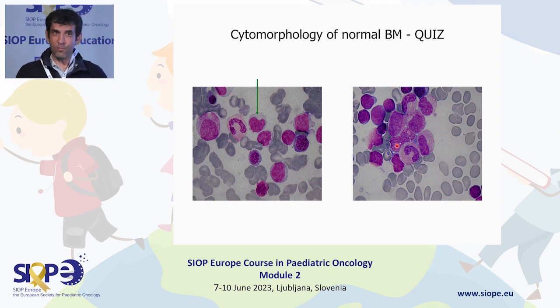Yeah, it's a lymphocyte, in fact, but this patient had an infection, so it's an activated lymphocyte, which may have a nucleus looking like a nucleus of a monocyte. So it's a monocytoid lymphocyte. You're completely right. Great. What's this?